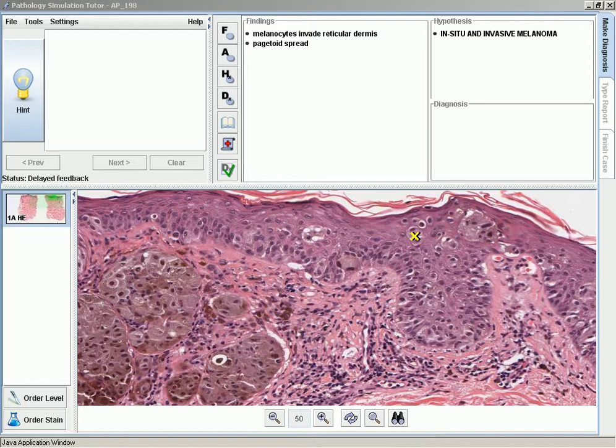As long as you are making correct diagnoses, you will most likely be examining, diagnosing, and reporting these cases similar to how you would in your normal practice. However, if you make an inaccurate diagnosis or a critical diagnostic error, the system starts what might be considered tutoring or teaching activities. At this point, your examination of the case will cease to mimic your normal workflow. This is similar to how current CME activities may provide subsequent and necessary learning activities requiring more time.